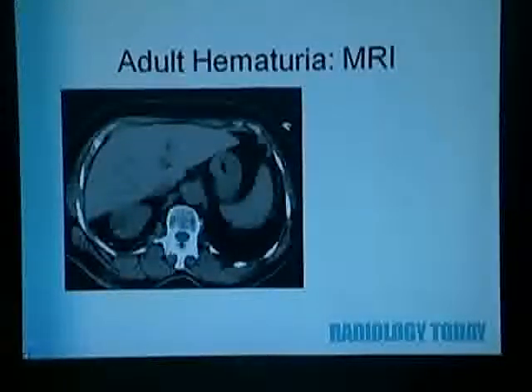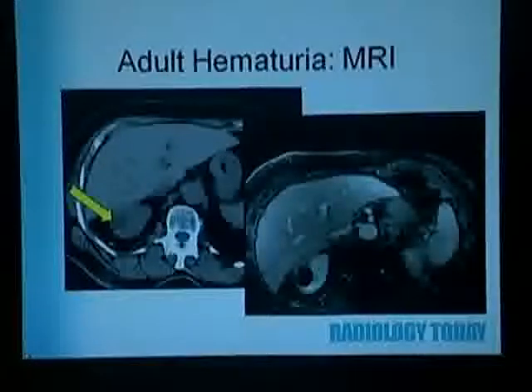Here was a CT obtained for other reasons, which revealed a cyst in the right kidney. And you can see dependently within the cyst, there's at least some mural calcifications. Now at that point, it's considered a minimally complicated cyst, and you could either do an MRI or a CT with contrast protocoled for evaluation of that cyst to further evaluate. They chose to do an MR at this time, which revealed no enhancing components, and that's very important. You may hear us throw out the terms Bosniak-type cysts, and we gave it a Bosniak 2.